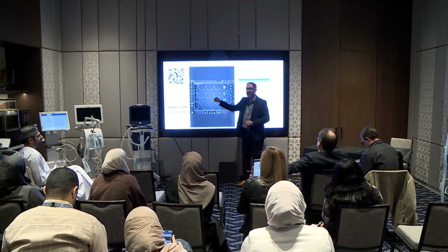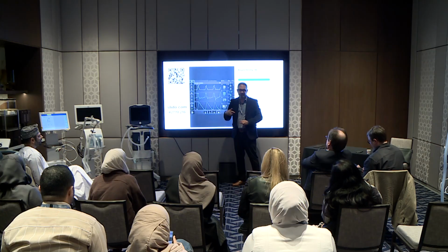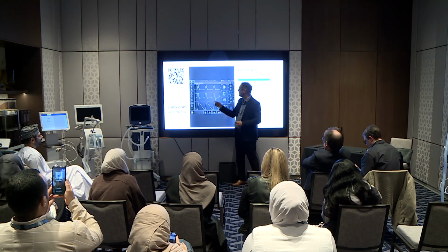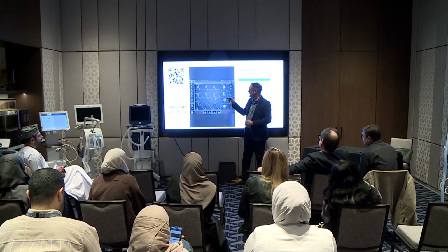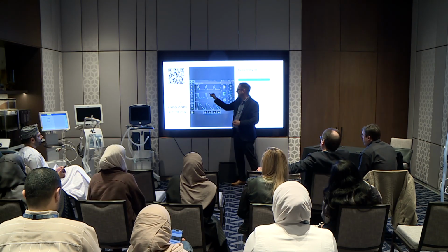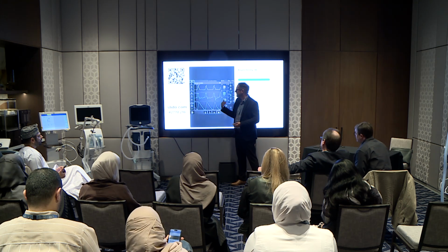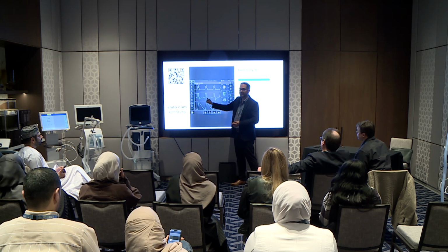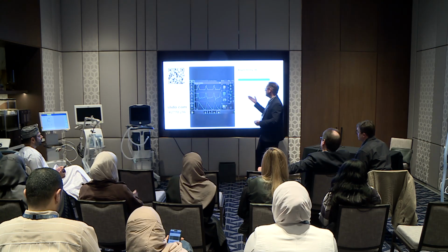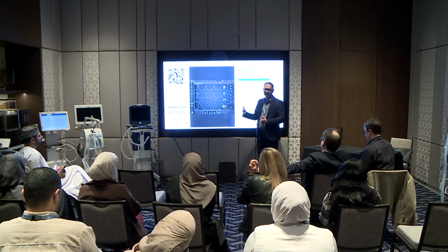So this pause is intentional. Just because you see a pause doesn't mean it's necessarily delayed cycling. I've set this pause to show plateau pressure on this ventilator. Delayed cycling would imply that they triggered and now they wanted to cycle off sooner. They didn't start their breath probably until here somewhere, and it cycled off before they were even done, so it's definitely not delayed cycling.